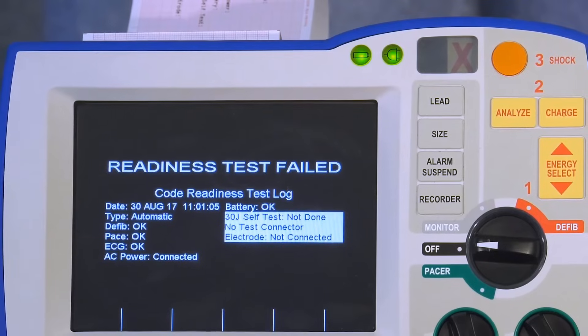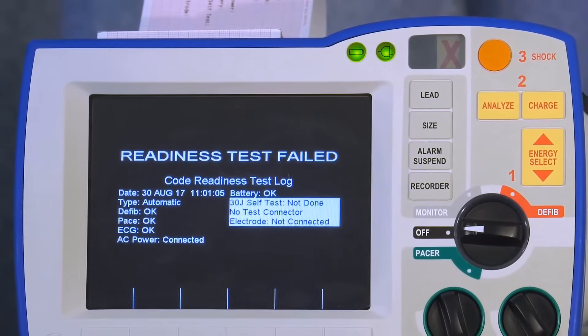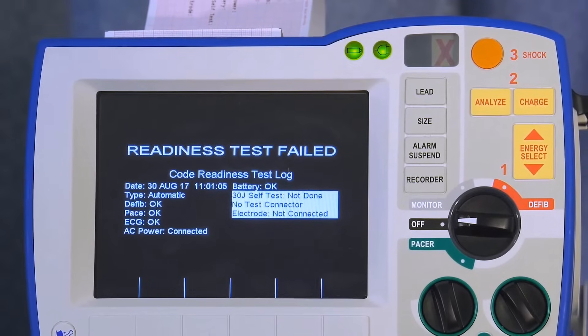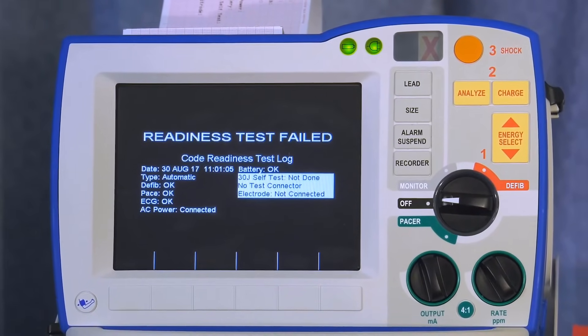Take the corrective action, such as replacing the expired electrodes, and perform a manual test. If the red X still does not clear to a green checkmark, call Clinical Engineering.